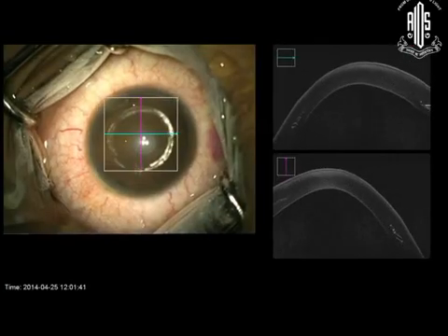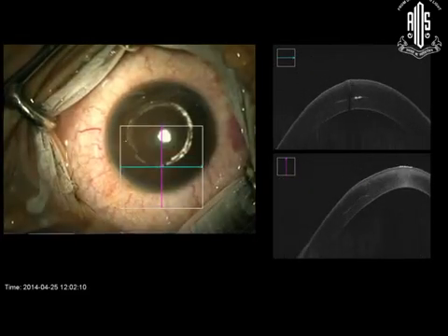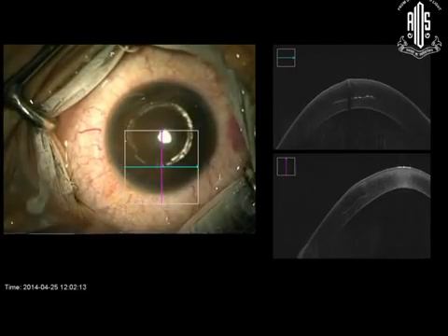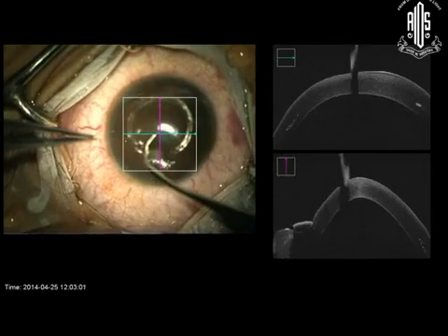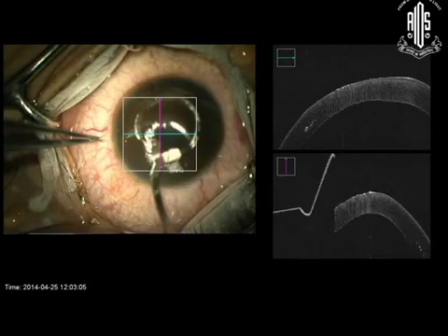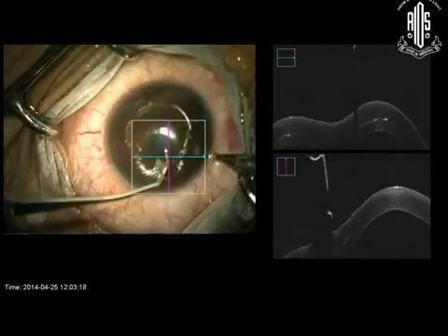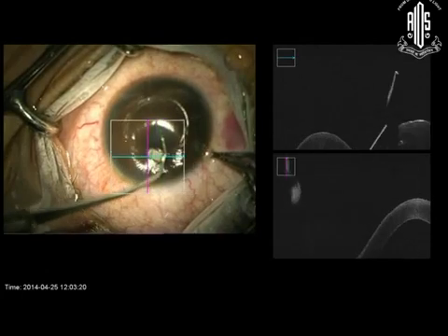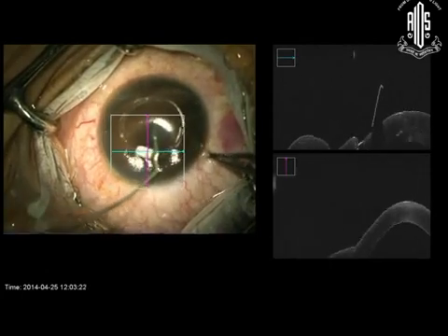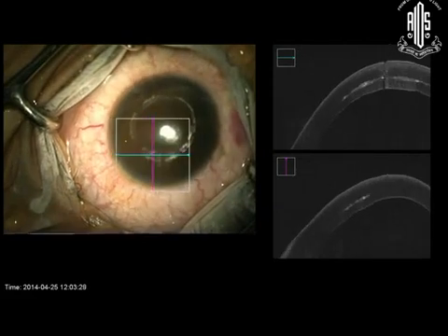With the help of intraoperative OCT guidance, we can minimize the complication of going into a false track. So when we open the channels with the dissectors, we know that we are going in the correct plane. We can clearly see the dissection of the corneal lamellae, that the plane is the same, not going inferior or superior.